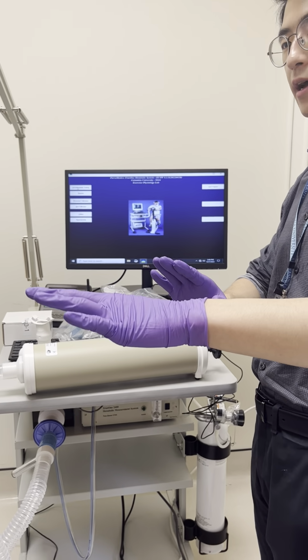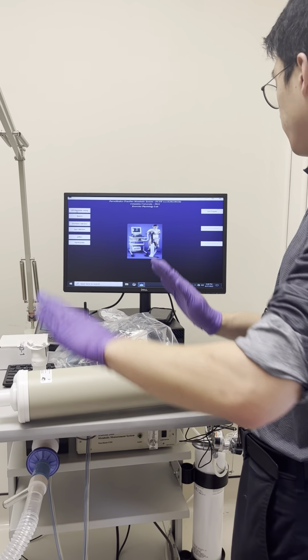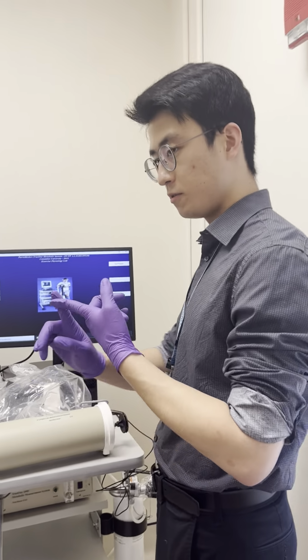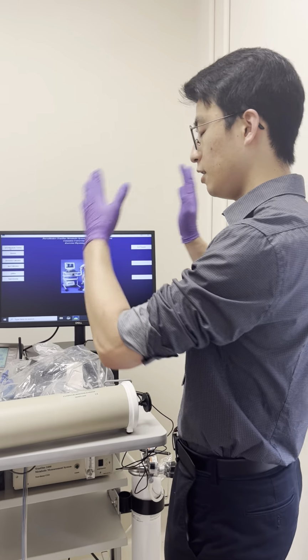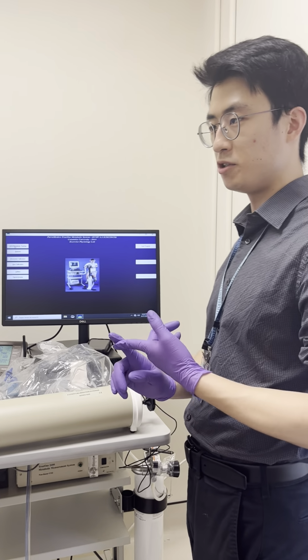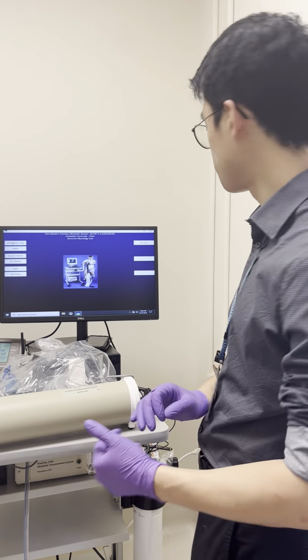You guys just went through the calibration, so everyone knows how to calibrate. There's 2 kinds of calibration, remember. There's a volume calibration and a gas calibration. Gas calibration is going to be performed immediately before the test. Volume calibration is performed at the beginning of the day.